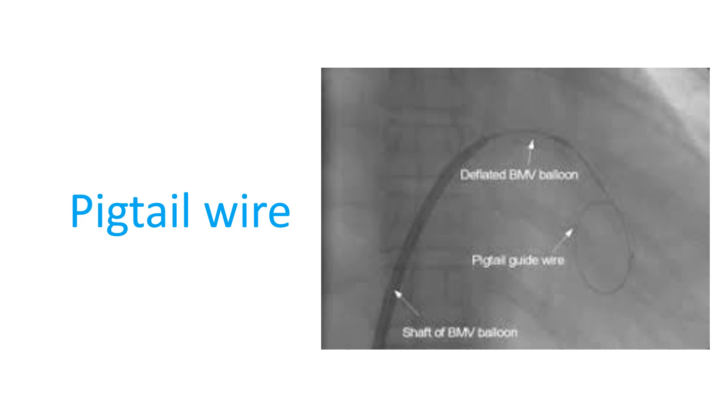Once the needle is safely inside the left atrium, the Mullins sheath is advanced over it into the left atrium. Then the needle is withdrawn and a pigtail wire is introduced into the left atrium through the Mullins sheath. The pigtail wire curls in the left atrium with its top portion reaching the roof of the left atrium.